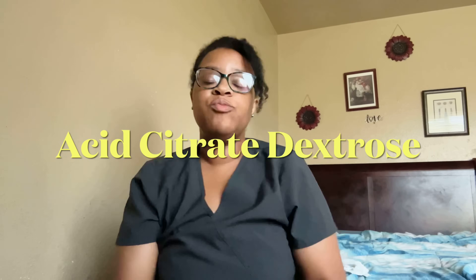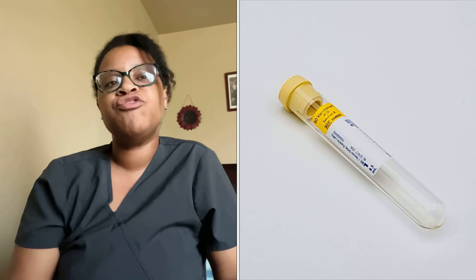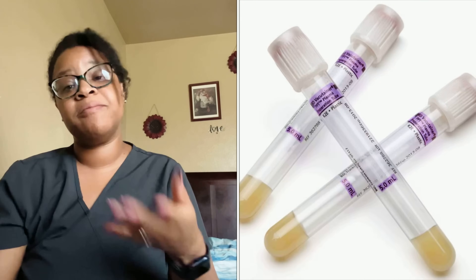The next tube is the ACD, which stands for acid citrate dextrose. This yellow tube is used in special testing — I've only used it maybe twice in my whole phlebotomy career. It can help with DNA studies, cytometry, tissue typing, and genetic risk assessment for patients. It comes in solution A or B. You invert it eight to ten times, and it is whole blood.